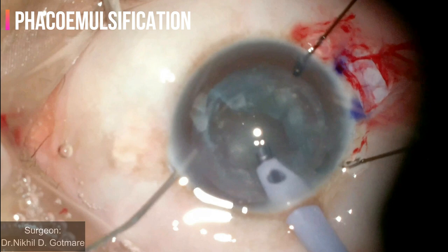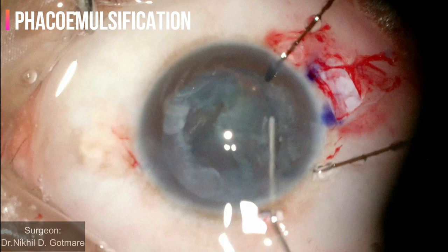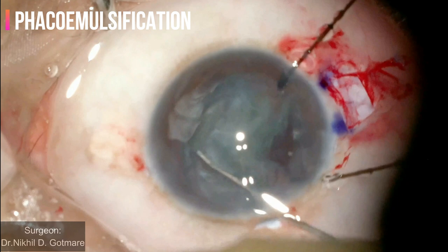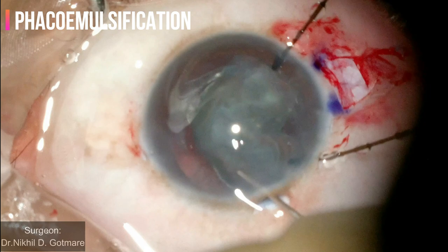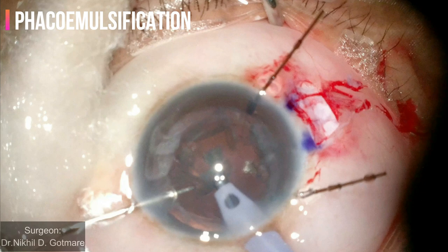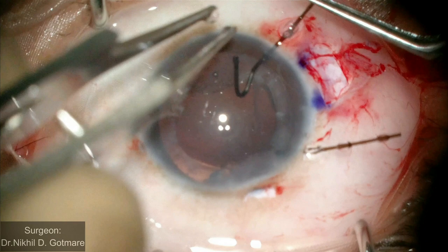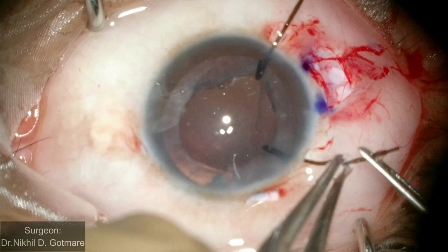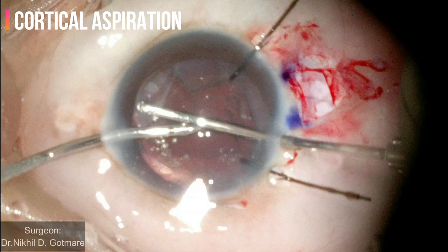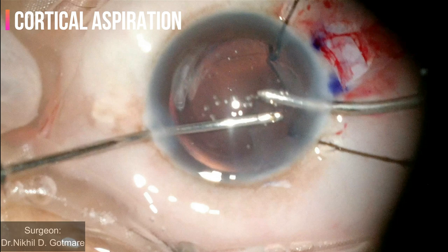Viscoelastic is injected before coming out to prevent collapse of the AC. The epinucleus sheet is separated and lifted out first using hydro and then by injecting dispersive OVD beneath it — this is known as viscodissection. Once separated, emulsification of the epinucleus becomes very easy. Capsular hooks had disengaged during phacoemulsification, so they are readjusted to hook the capsular margin. Cortical aspiration in the normal area is done by radial pull, but in the area of subluxation a tangential side-to-side sweeping motion is used to remove the cortex.